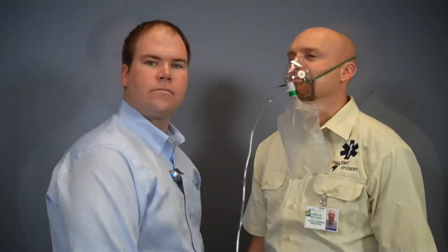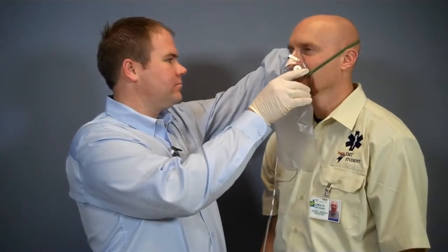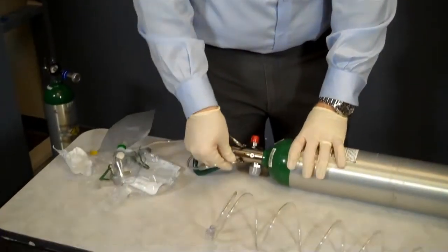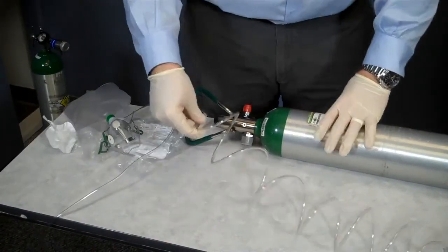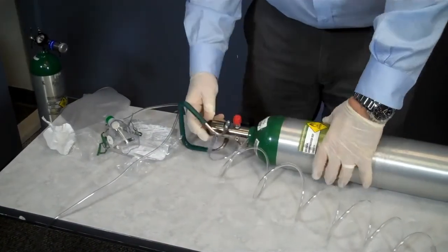If the patient does not tolerate the non-rebreather mask, I may be able to switch to a nasal cannula. I will remove the non-rebreather mask from the patient and regulator, then connect the cannula to the oxygen port valve on the regulator.